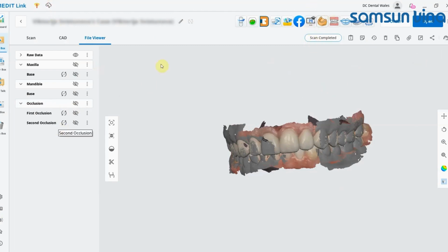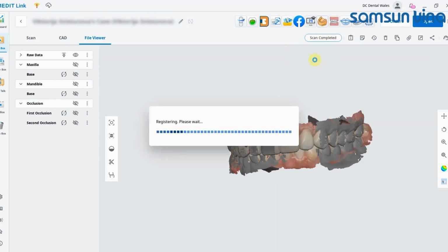So you'll have to find the case. It'll say process required. You click on it, click process now, and it will try and process it again. If it hangs up again, what I would usually do is open up the case, wait for all the scan data to load up, and then go to a small area that is insignificant, so maybe a little bit of stray data that you don't need, and just make a change to the scan, just a slight change. So just chop a little bit away and then save the case again, and this will often generate a different processing process, and will often work that second time.